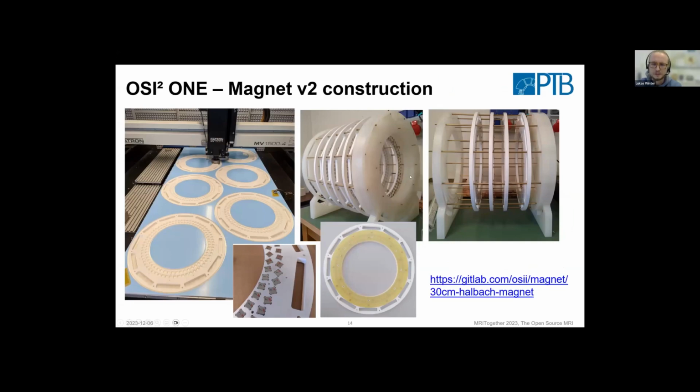Other things will be easier to rebuild, as you can see in this image: there are screwable lids, so there will be no glue used. So you can also reuse the magnets if you want. They are not cheap, so if you make mistakes, it's not a bad idea to be able to replace them in a different configuration. There will also be fewer screws, so this will hopefully be faster and easier for others to rebuild.